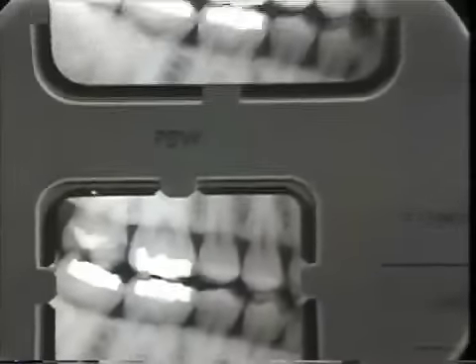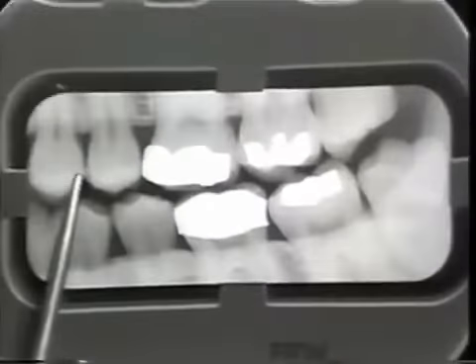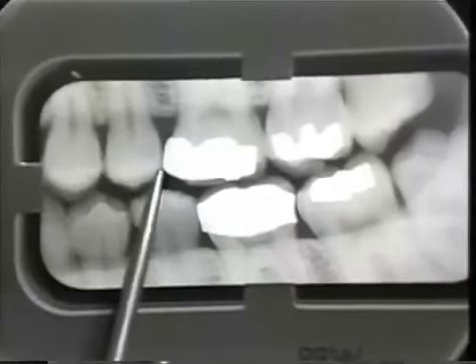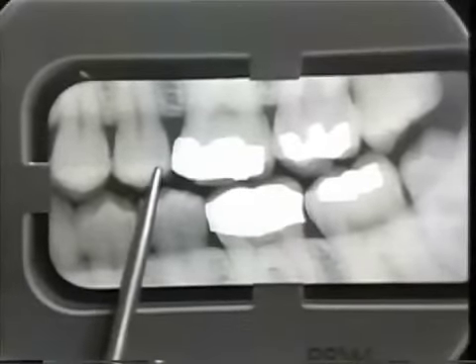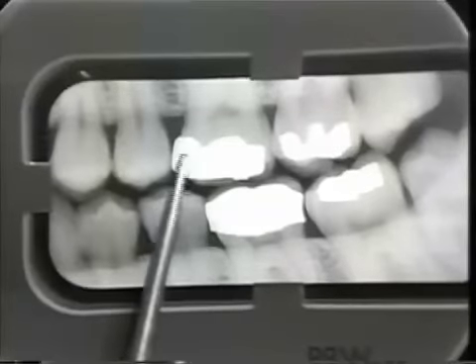If we continue here, tooth number 12, 2, has a small carious lesion, again incipient, and one we will observe. 13-2 is the same. Here on number 14, we have a good restoration, a little heavy on the contour at the cervical.